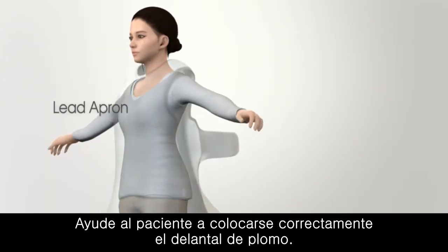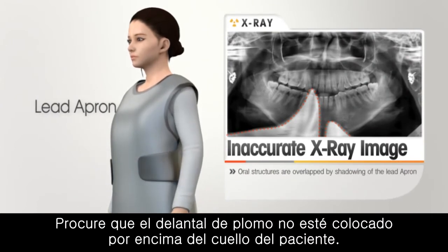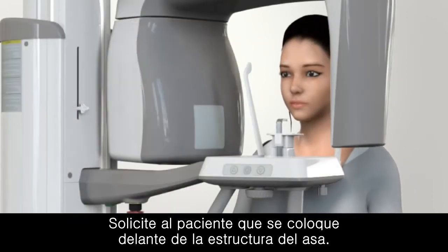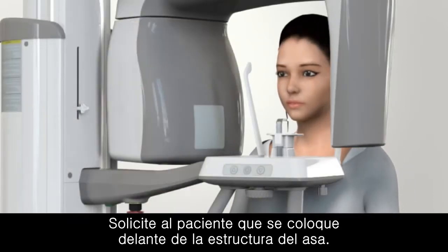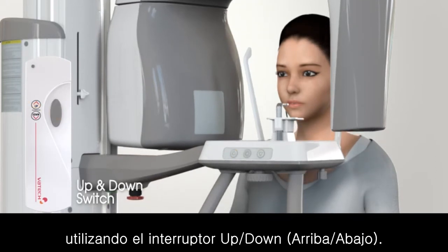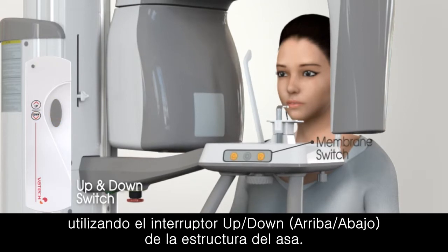Assist the patient to appropriately wear the lead apron. Be careful that the lead apron is not above the patient's neck. Ask the patient to stand in front of the handle frame. Adjust the chin rest position approximately to the height of the patient's chin using the up-down switch. For PACS eye, the chin rest position can be adjusted using the up-down switch on the handle frame.